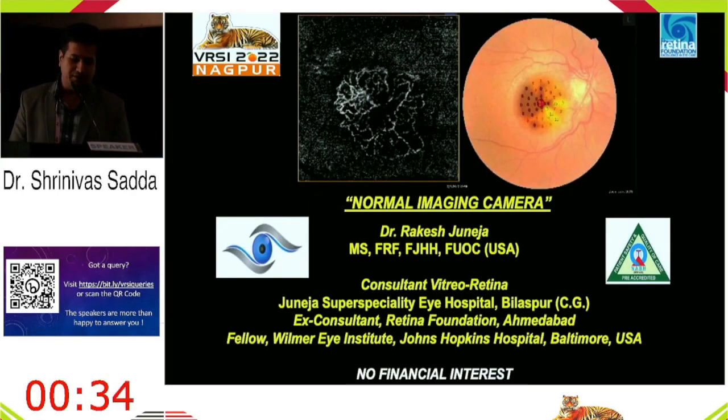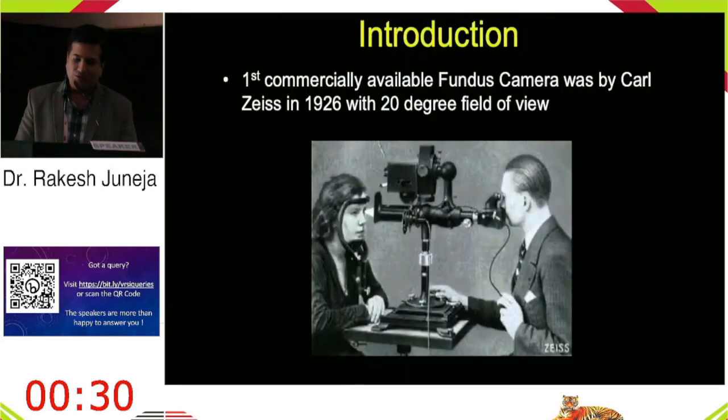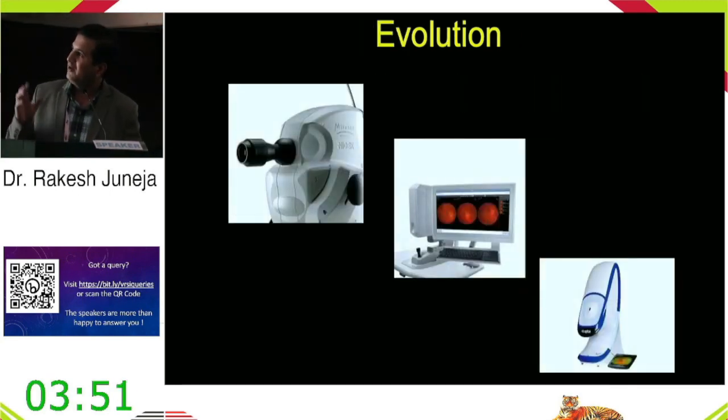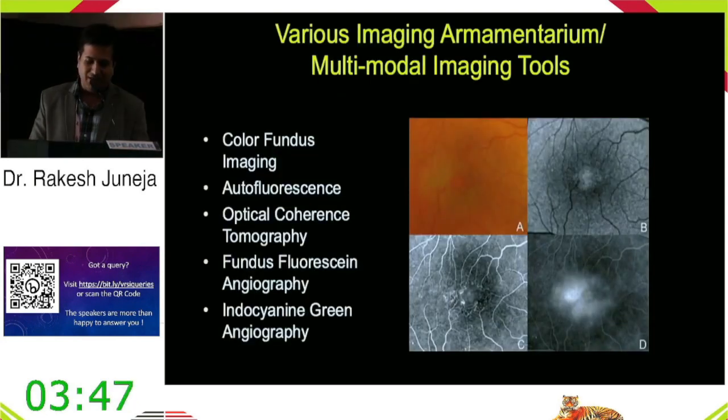Listening to all the pros for ultra wide field imaging, let us look at why we still need to drive the old technology, and why it still holds true. We started back from 1926. This was the first fundus camera that came to light. Although we have evolved to ultra wide fields, the Mirante, the Optos, and the Clarus, one does not need ultra wide field in all clinical practice.